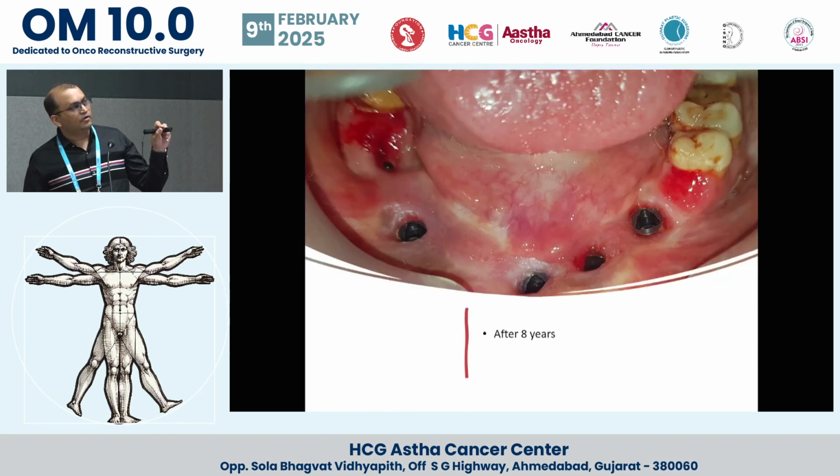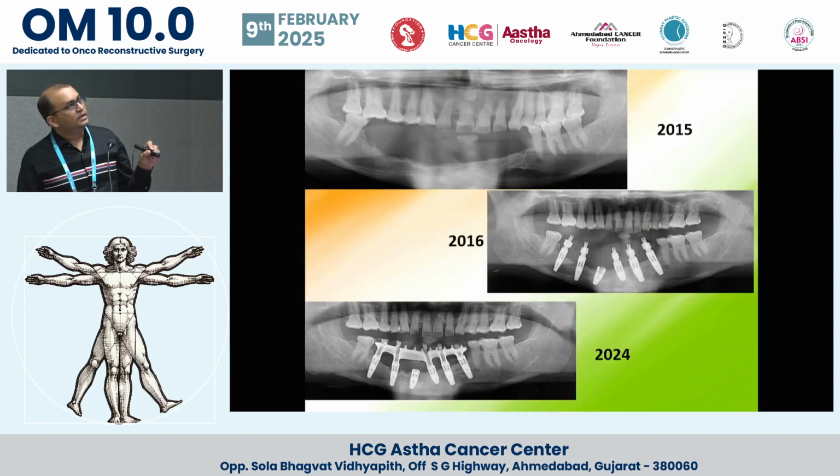This is 8 years follow-up, the longest follow-up I have. You can see all the skin has gone, hairs have gone, and mucosa is totally mucosalized with good attached keratinized tissue. So this is how it went from here to here to here.